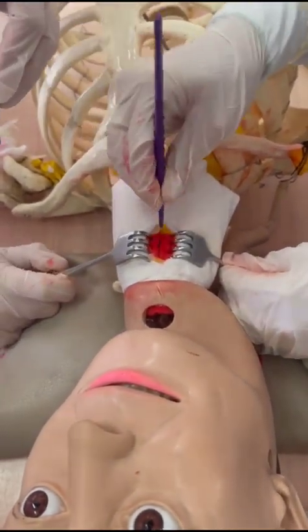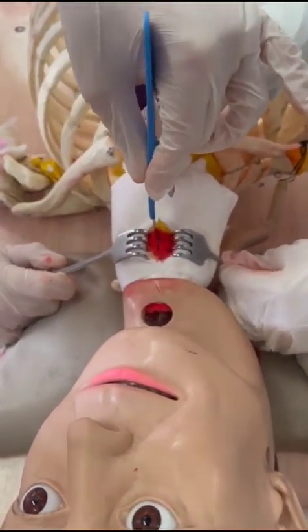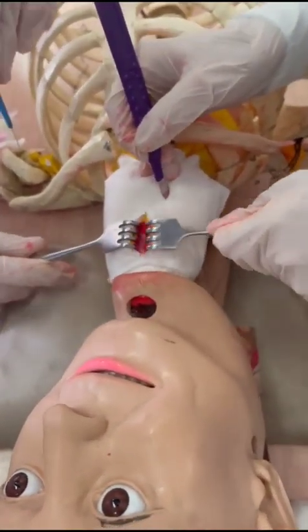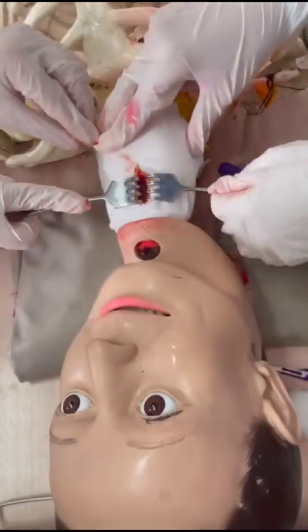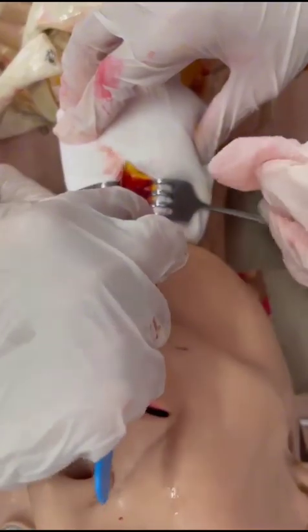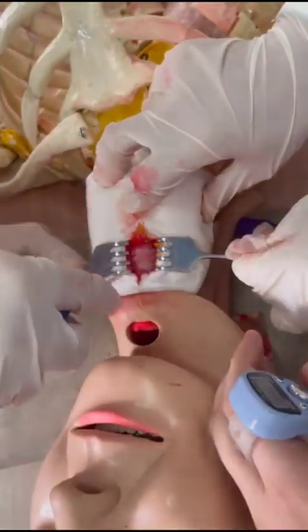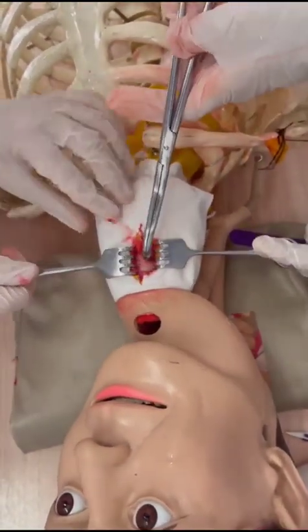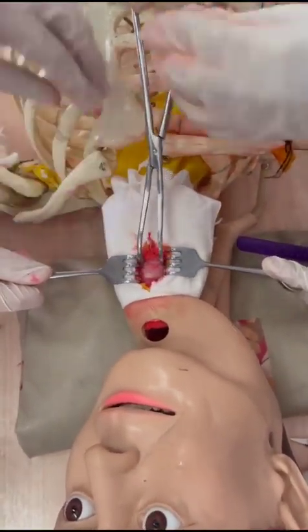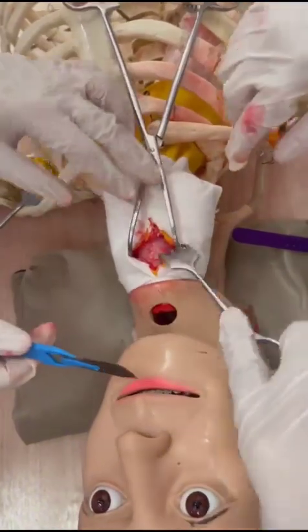rings. The width of the tracheotomy window should never exceed a third of the diameter of the trachea, and generally one should be as conservative as possible. If a window is created, a maximum of 2 tracheal rings are partially excised. This step is done with sharp dissection using a number 15 blade knife. Care is taken not to damage the underlying endotracheal tube. The tracheotomy window is secured and controlled either with tracheal dilators or with a blunt cricoid hook.